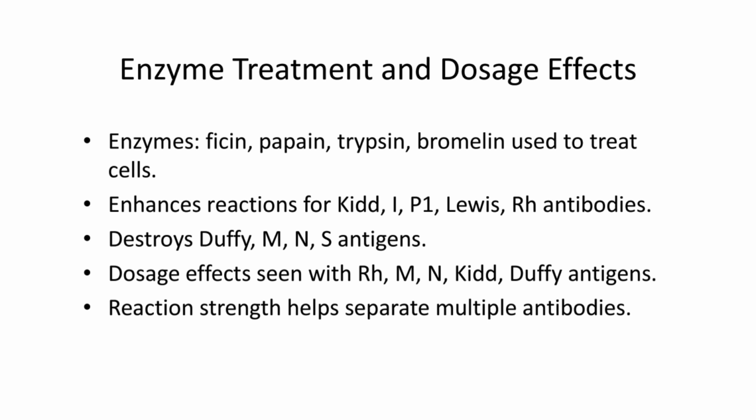The phase of reactivity, whether the antibody reacts at room temperature, body temperature, or in the AHG phase, provides clues to its identity. A positive autocontrol across all panel cells may suggest a delayed transfusion reaction or the presence of an autoantibody.